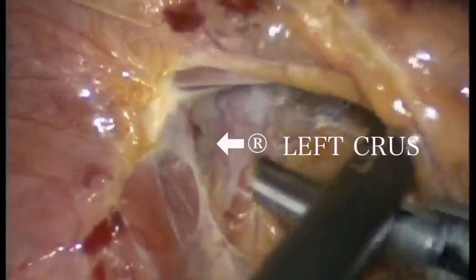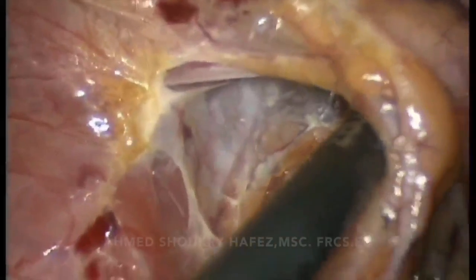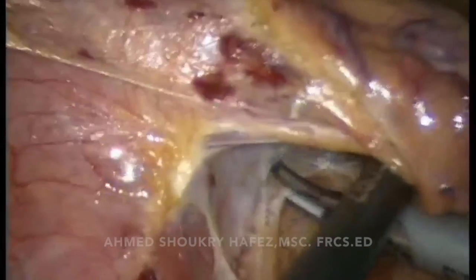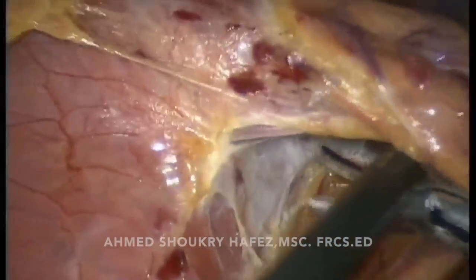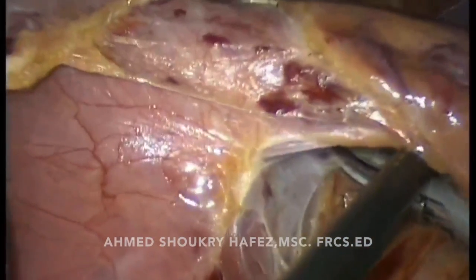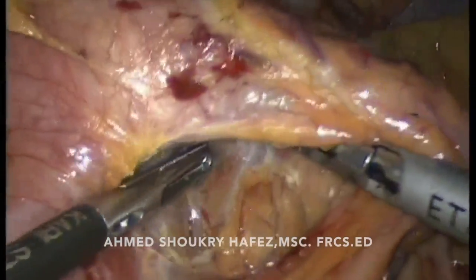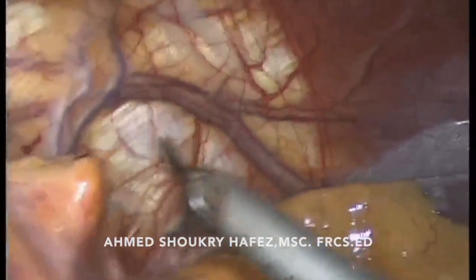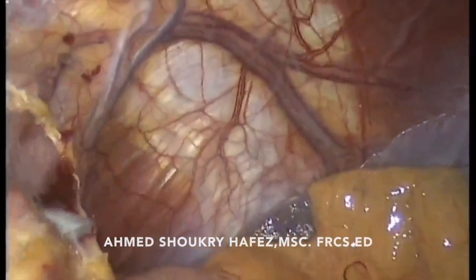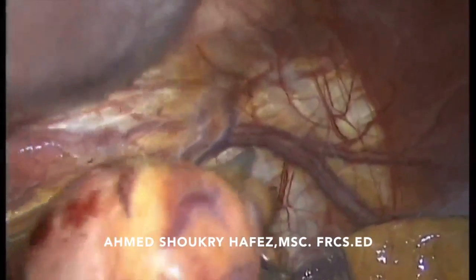Now we have developed the left crus lower down. So now we have delineated the left crus in its upper part and in its lower part. And now we are dissecting the esophagus posteriorly from the left crus, to which it is intimately related, to pass behind to create a tunnel and put a tape to pull on the gastroesophageal junction for the remaining part of the surgery.